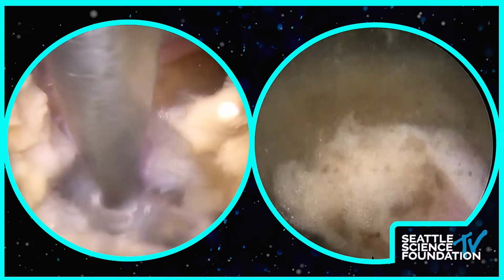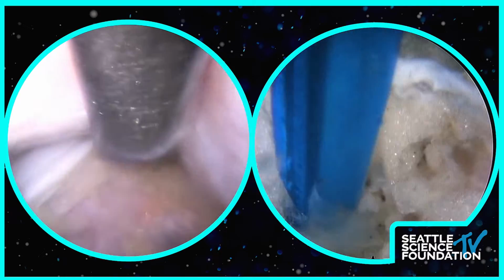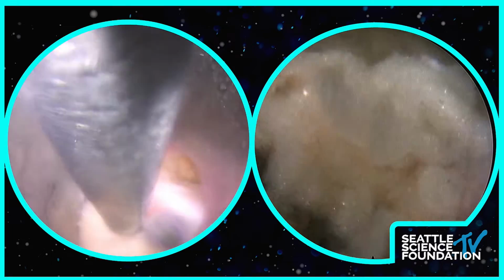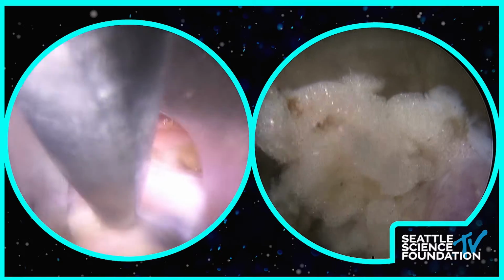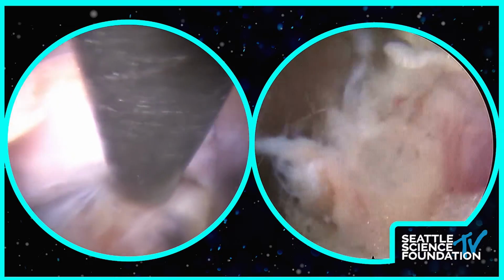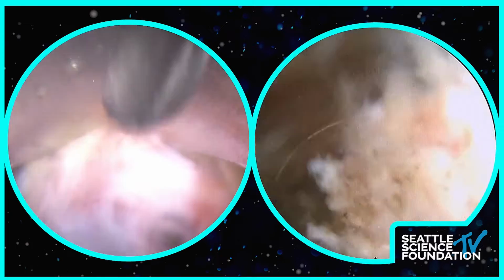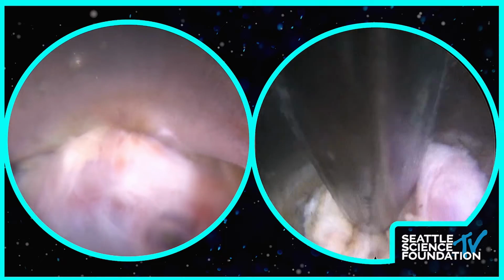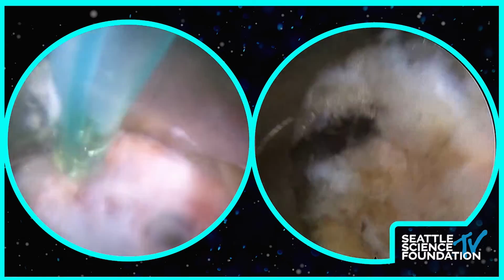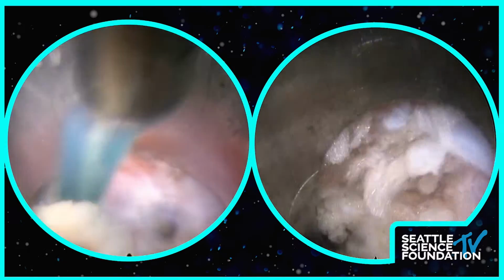So my preference is to go from the shoulder, use a blunt nerve hook to medialize this traversing root, and then use this tube as my nerve root retractor. I'll place this tube all the way to the level of the disc and leave that blunt nerve hook in place. As you rotate, my bevel edge is now medial, opening to the lateral. Now I have the nerve retracted, so this is all safe here, and this is the disc. If I see a disc herniation, it will be right here.